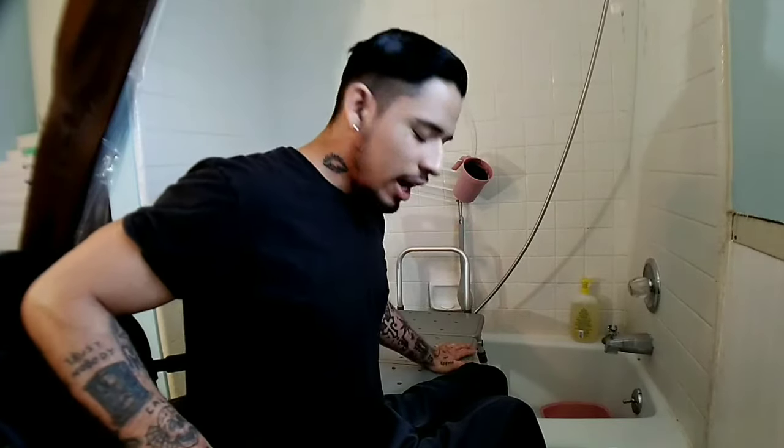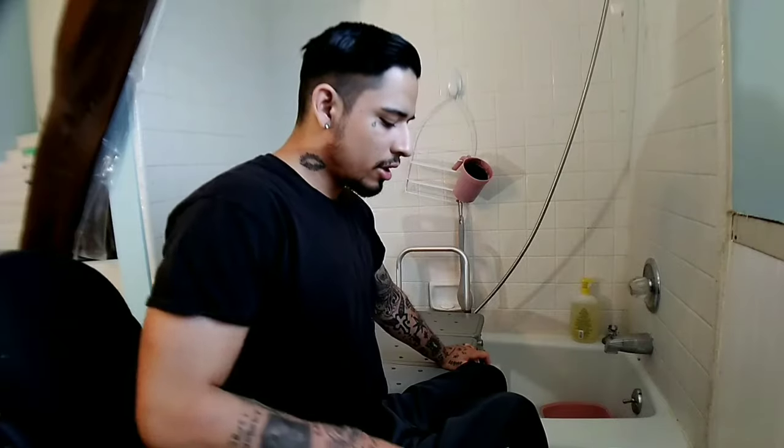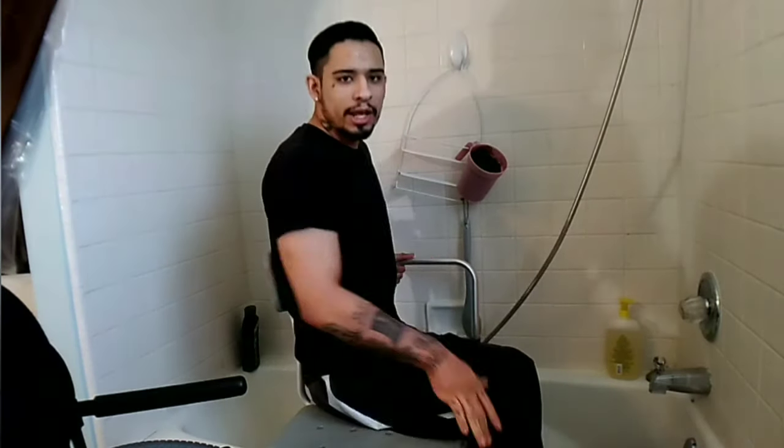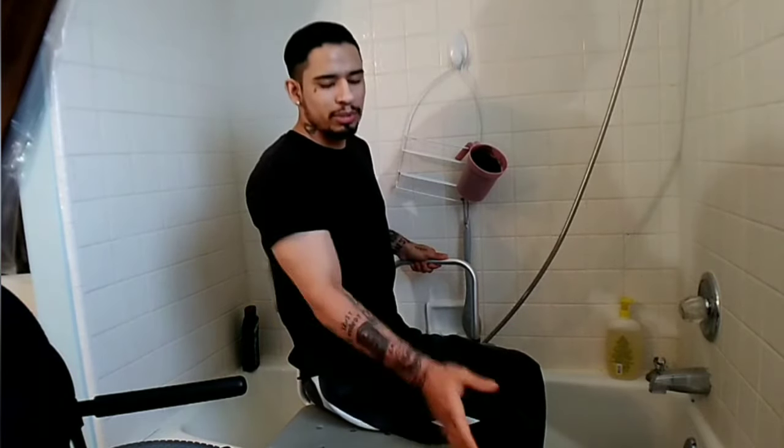What I do next is I put my hand on the seat and my other one on the armrest or on the wheelchair — doesn't matter. And then I just lift up and transfer. You can use a sliding board if you want — I might make a video on how to do that. Then you just keep sliding over, and I'll show you how I balance myself while picking up my legs.